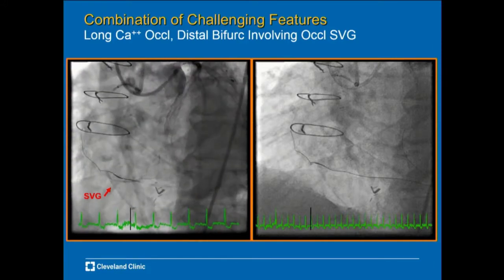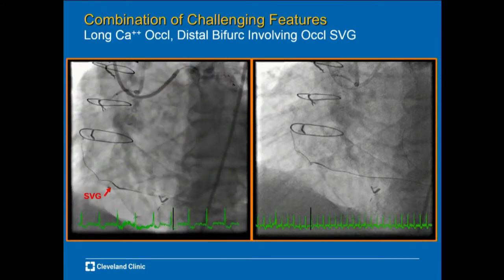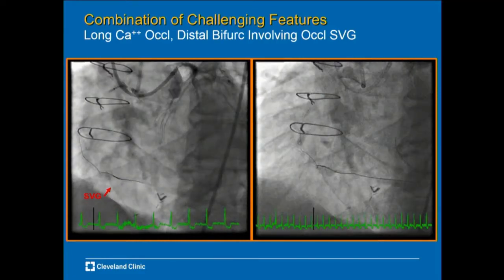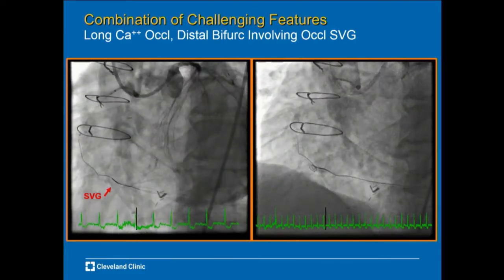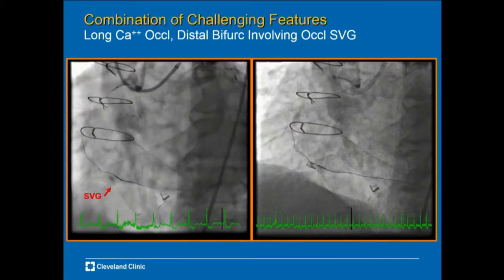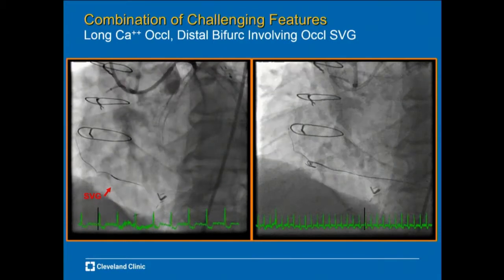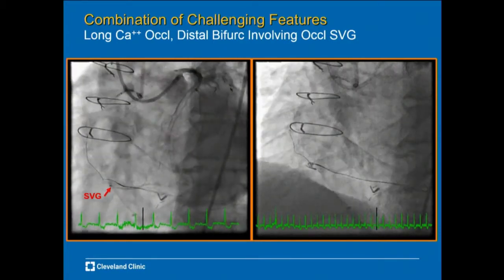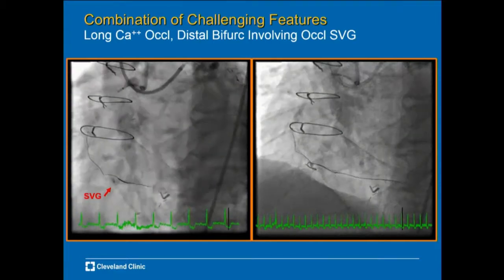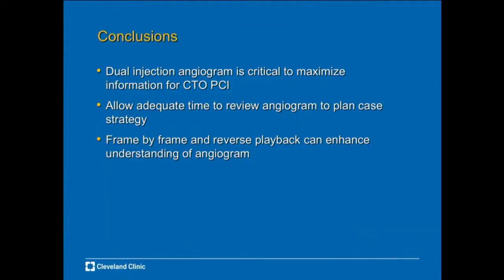This is a patient who has an occluded vein graft at the crux of the right coronary artery, and the retrograde wire would just go up the vein graft. So we actually had to advance an antegrade subintimal wire simply to aim at, to perform a retrograde knuckle and get up the right coronary artery. So sometimes it's not the angiogram, it's just having a guide wire in position to aim at. But these are all little tricks to try to get the case done.